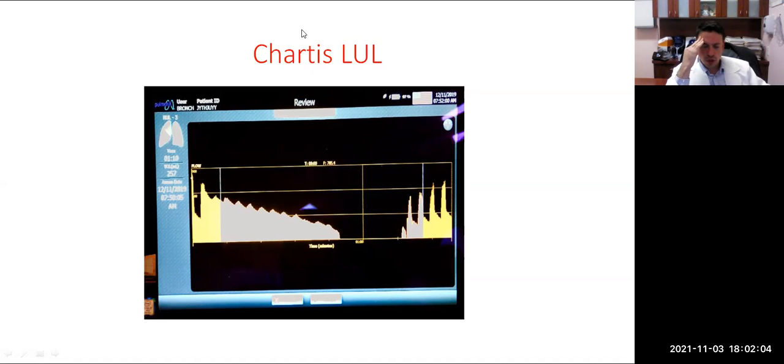Yeah, sometimes, it's a good question. If you do lower lobes, because valves go anywhere, in the lower lobes you have this phenomenon that has to do probably with maybe air trapping, or maybe just distal atelectasis developing, where the flow will go down and then it sort of starts to choke and click, because basically there's no flow coming back.